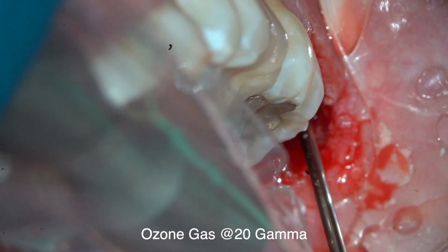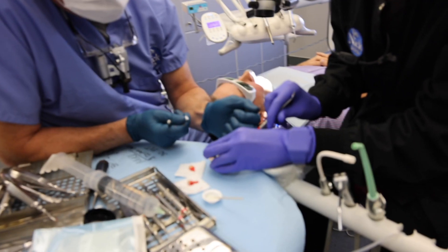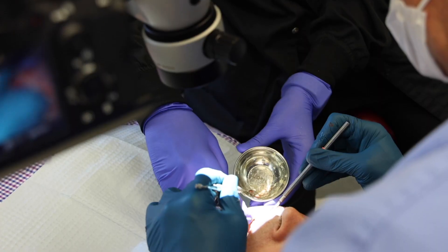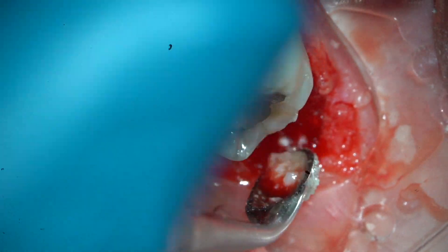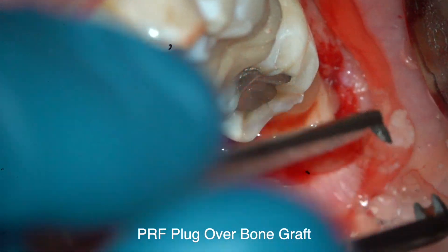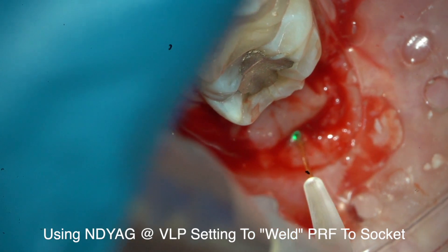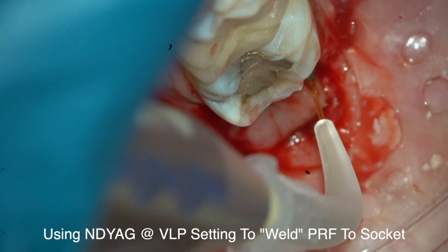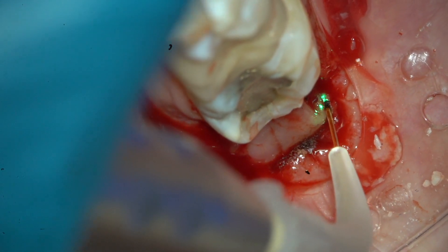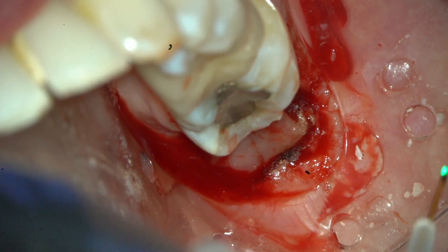Mix it around like you're doing some IRM. You're going so fast — well, I think Mike's a little sick and tired of this, but I would be too. Can I get an alcohol bath please, a wet one? You seeing it well? Yeah. Is my retraction okay? Uh huh. Good. He's like, can you guys get out of my mouth?